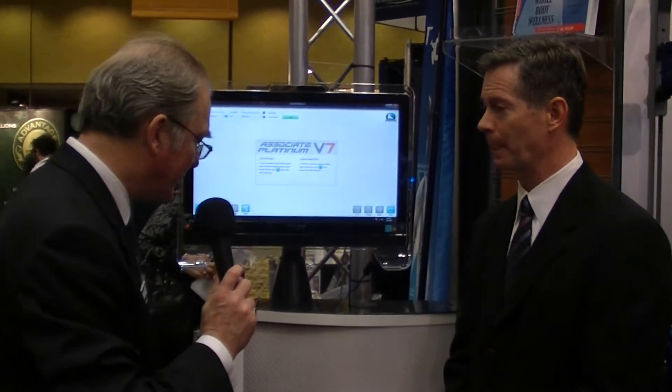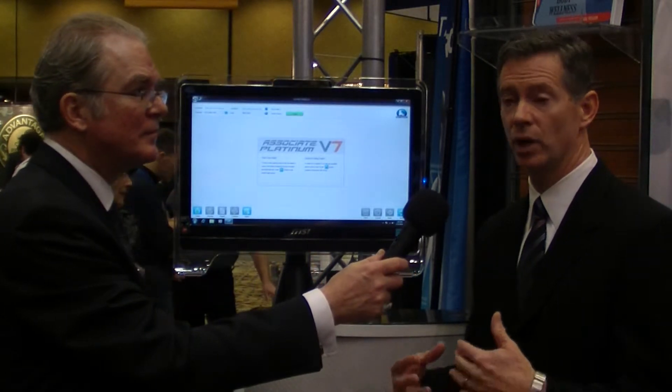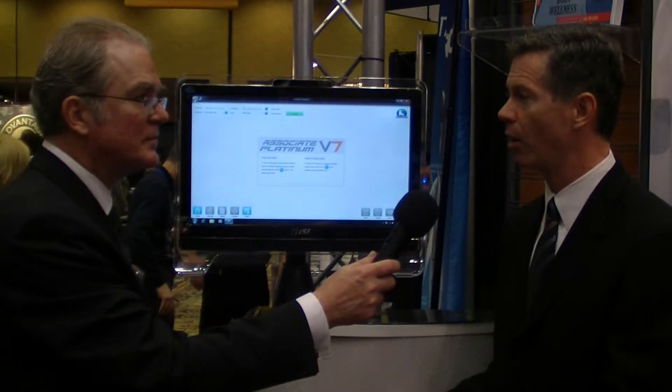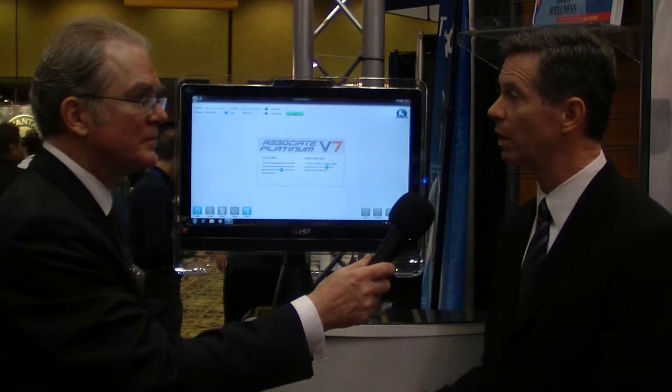This looks like it greatly reduces cable clutter. Yes, one of the things that doctors asked us about is how we could change the cable management system so that we don't have cables laying all about the doctor's office. So it has cable management built into it.